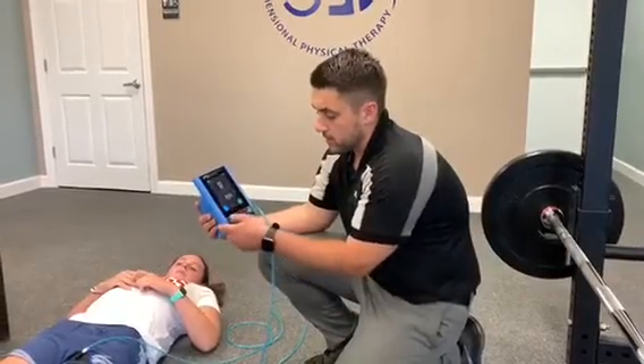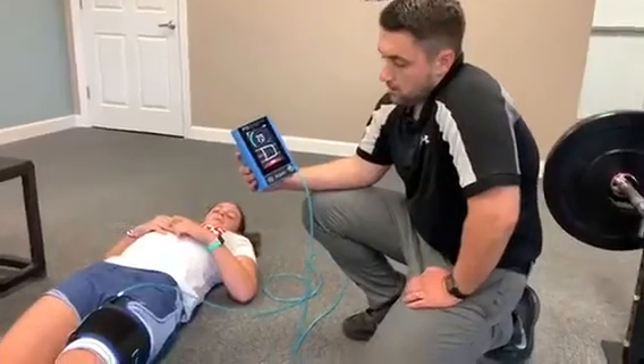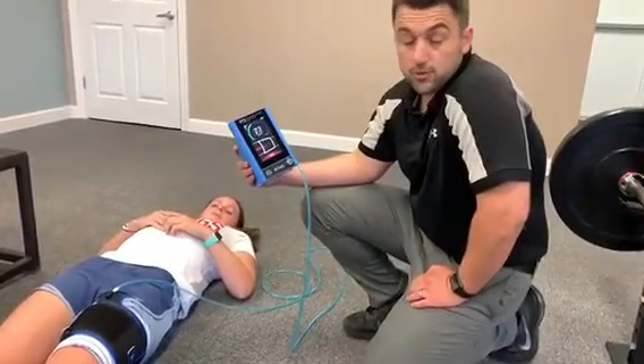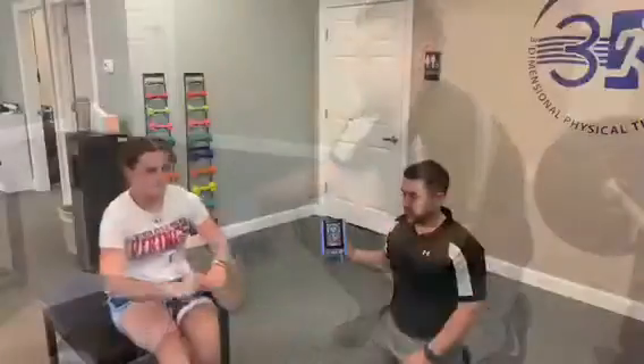First, what we're going to do is hit this button here. We're measuring how much pressure it's going to take to occlude 100% of the blood flow, and then once we get started we'll back it off to 80%.